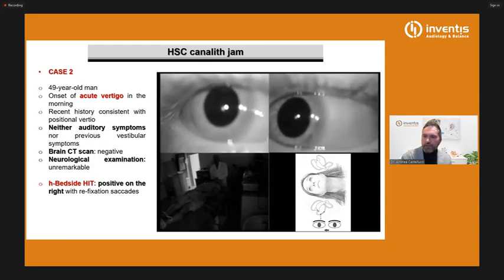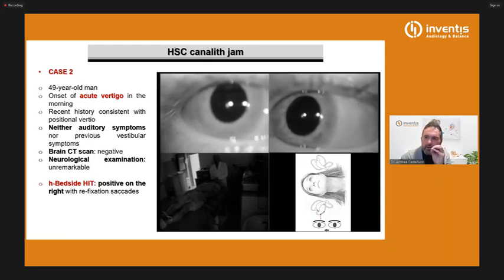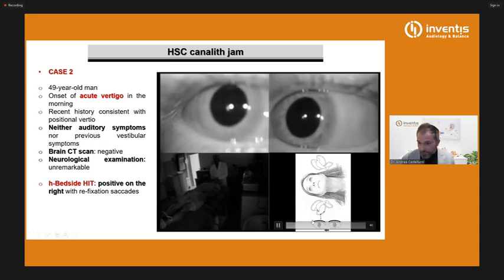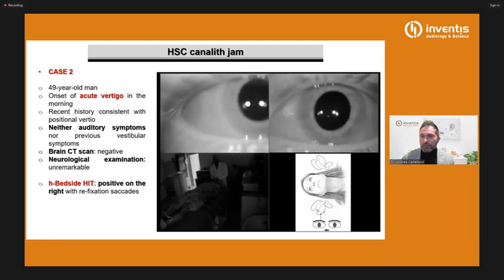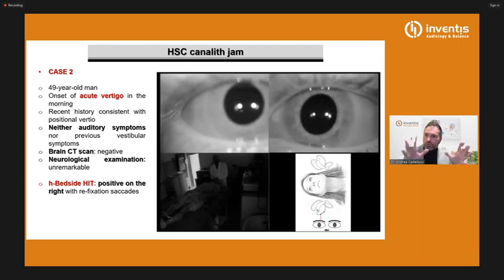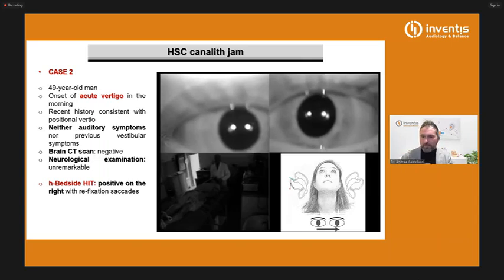Another interesting thing is that on the right, at the supine head roll test, it transiently, just for a while, reverses, because now gravity goes against the continuous negative pressure. But just for a while. Then afterward, it starts again to go in a paretic direction, toward the left.